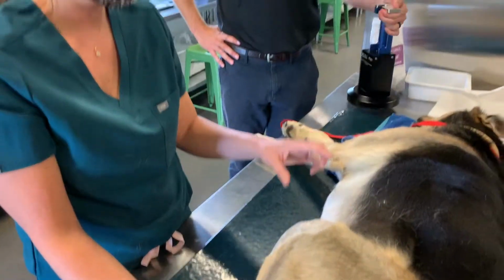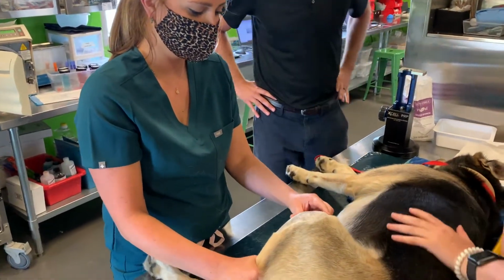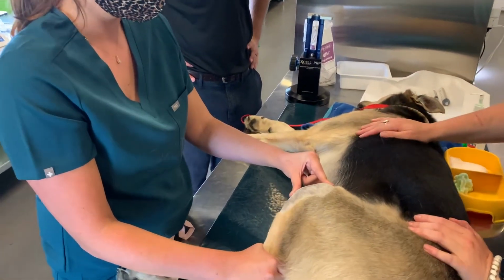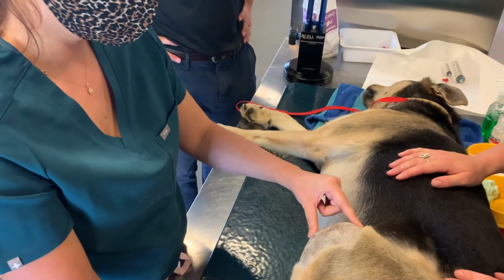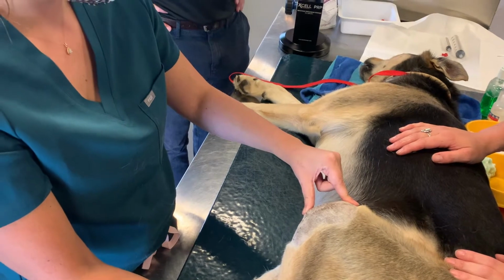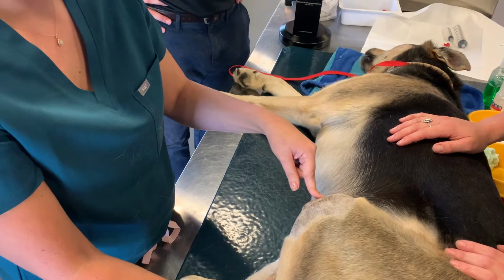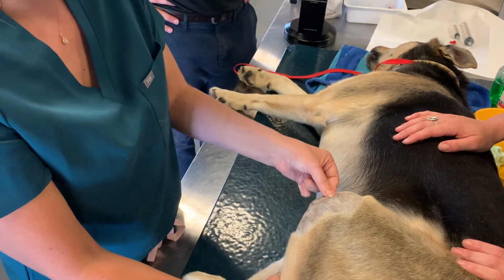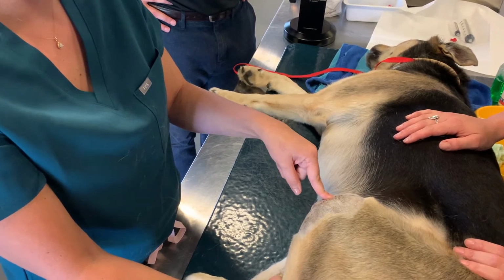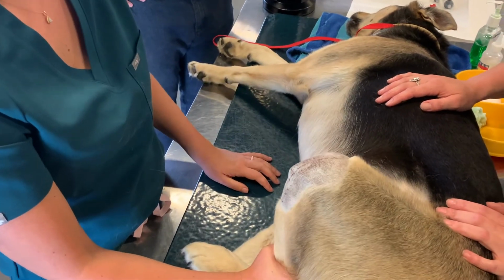Okay, so I'm going to inject a stifle today, and my landmarks for this injection, we're going to go on either side of the patellar ligament that runs across the front of the joint. The location for the injection is going to be halfway between the patella and the end of the tibia, and we're going to point the needle pretty much straight from the side of the ligament towards the middle of the joint. So between a 45 and a 90-degree angle. You can put them in dorsal recumbency or do it laterally and have someone hold the leg up and flexed.